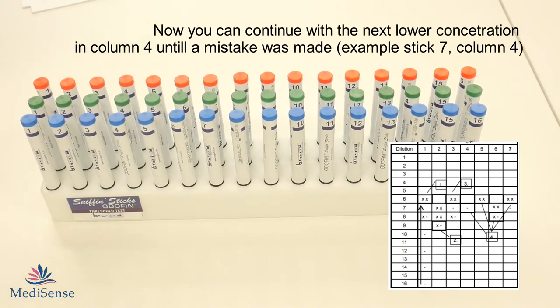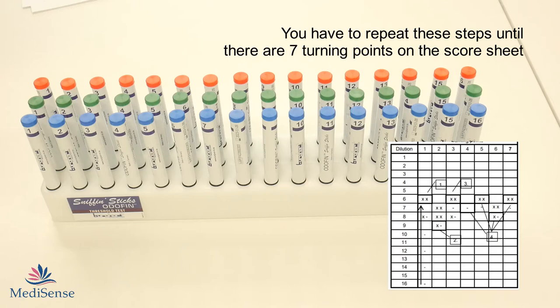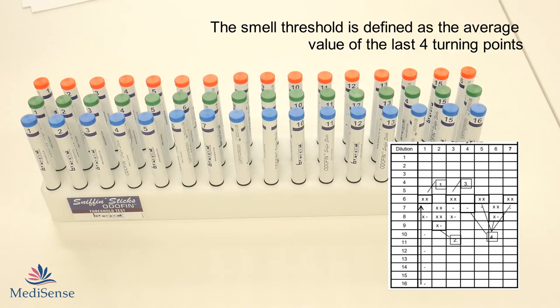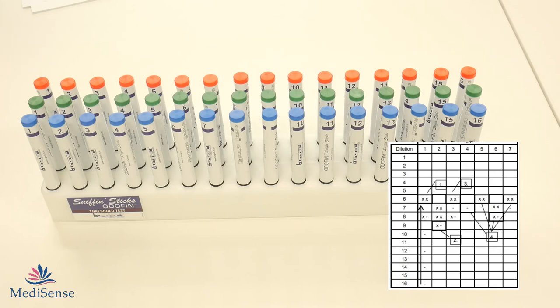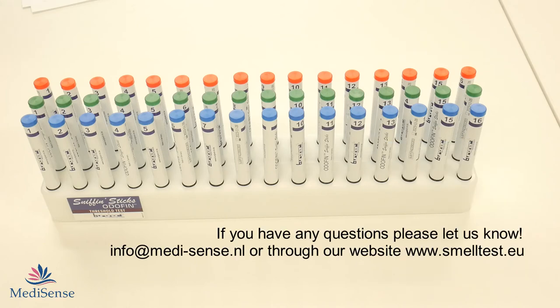The threshold test is finished when you have 7 turning points on your score sheet. When the test is finished you look at the last 4 turning points and you take the average of those 4 turning points which is the score for the threshold test.